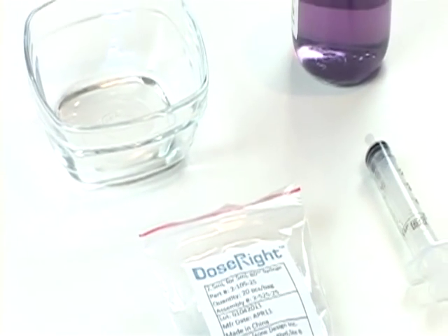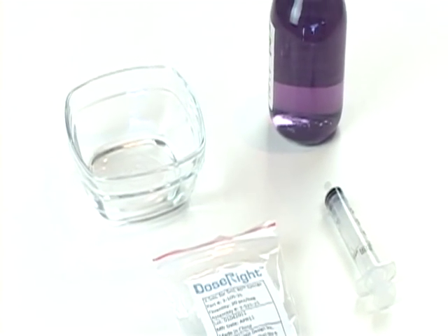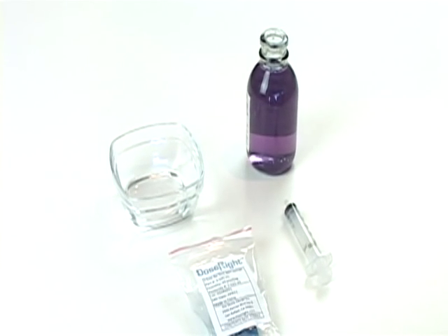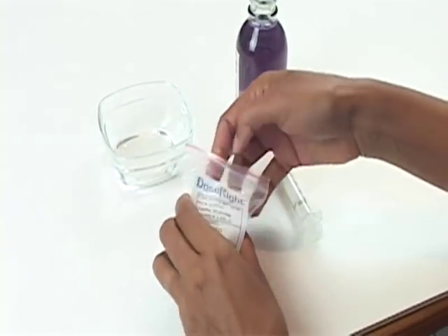This brief instructional video will guide you in the installation and proper use of the DoseRite syringe clip. For this video, we will be showing a 2.5 ml clip.